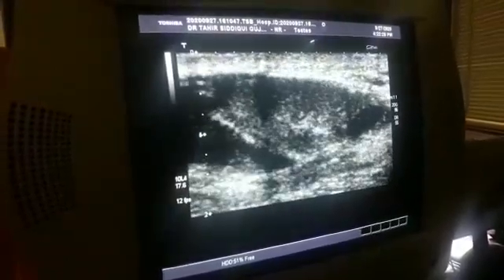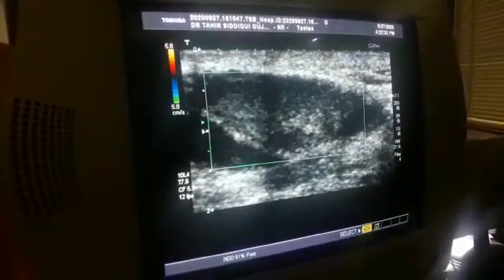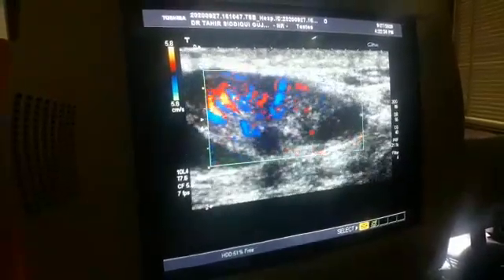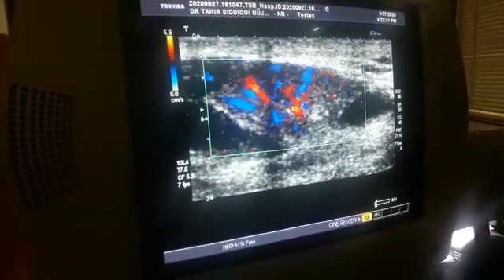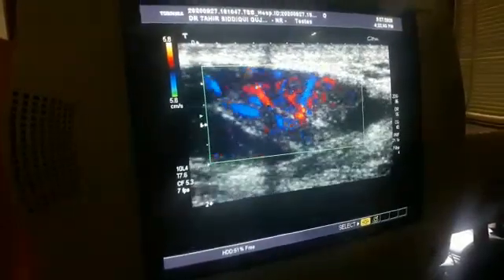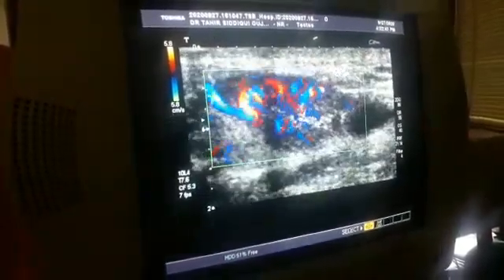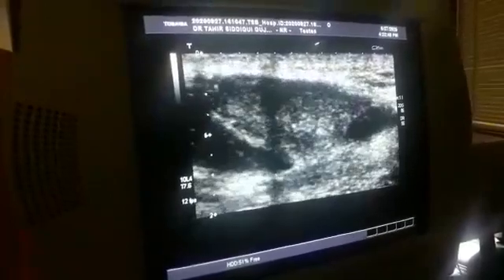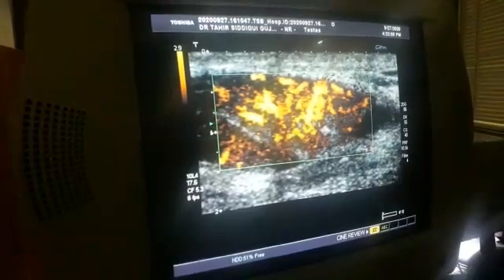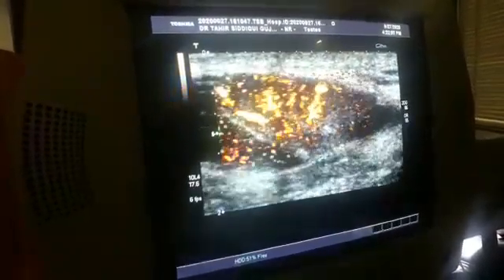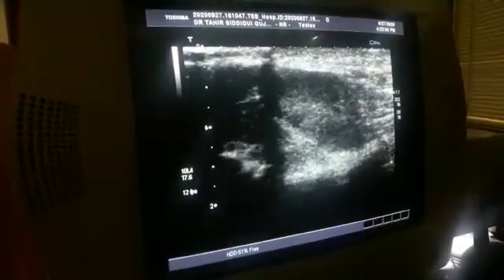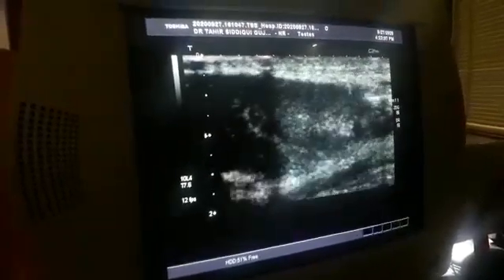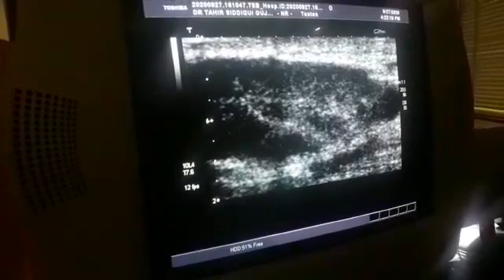And this is a left ectopic inguinal testis in a 30-year-old male. The right testis is not visualized in any scannable location by ultrasound, keeping in view its limitations and the age of the patient. It has no more than a scar, so further imaging modalities are required, as this is a condition which could lead to aggressive pathology later in life. Thank you very much — this is our case of the day.